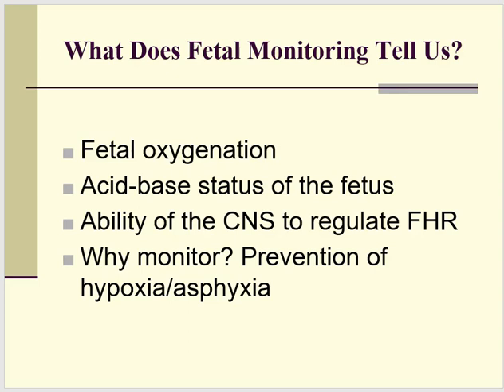So what does fetal monitoring tell us? Or basically, why do we do this? By seeing how the baby's heart rate changes, we are able to assess our status of fetal oxygenation. This also lets us know the acid-base status of the fetus. Go back to your block 2, remember your blood gases? This is the kind of information we're talking about here.